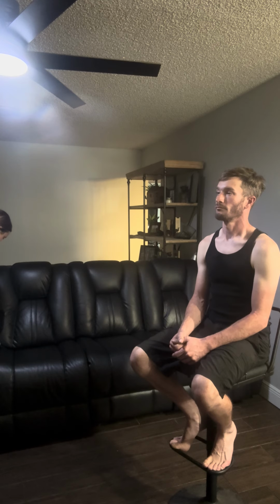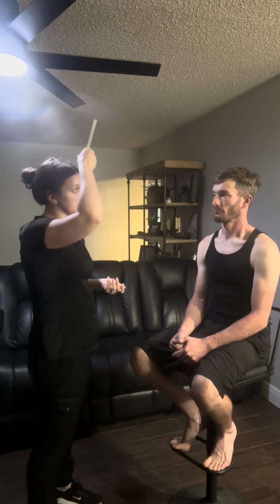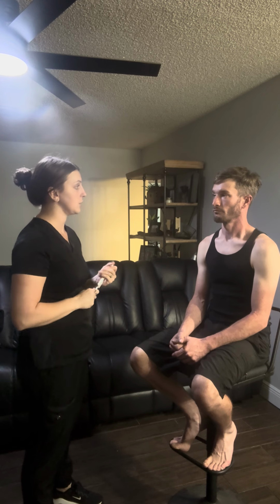And we're going to perform the Weber test. So I am going to tap this. You're going to hear a sound. It's going to be on the top of your forehead, and you're going to tell me if you hear the sounds equal in both ears, okay?